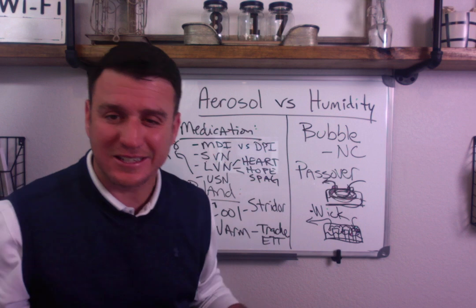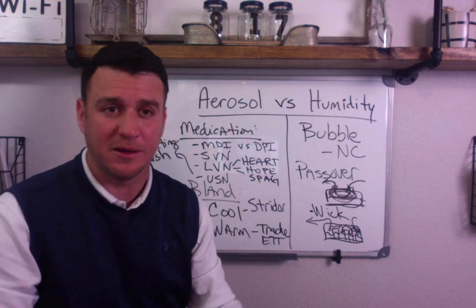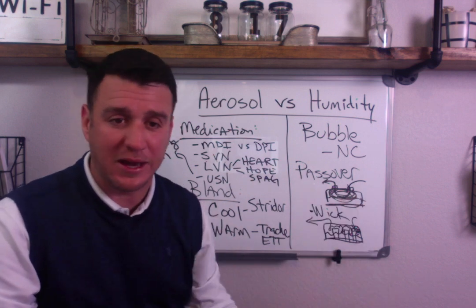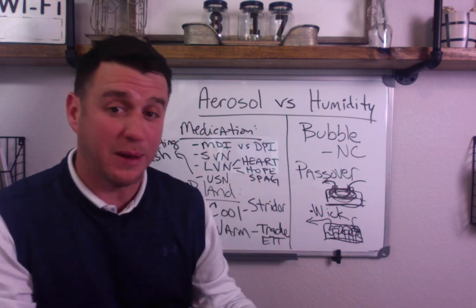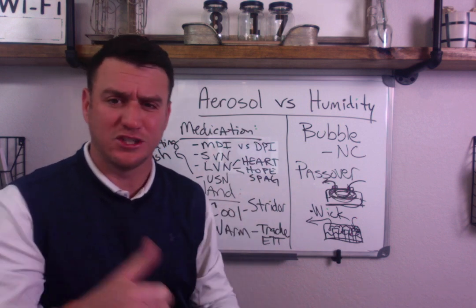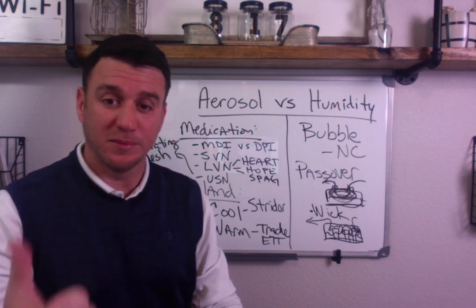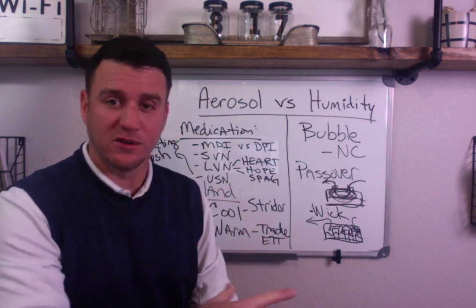These are questions that you just hate when you get to them on your TMC exam, because you go, holy crap, I forgot all about the wick and I don't know how it's any better than just the basic passover. Well, the answer is it delivers better humidity to your patient. Patient with super thick secretions, a wick passover humidifier will work better than a standard passover humidifier.